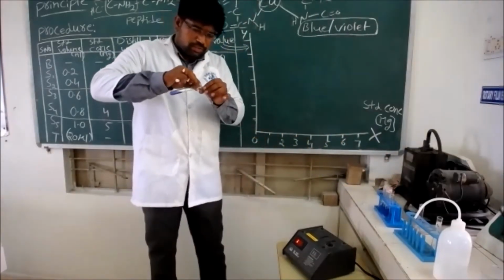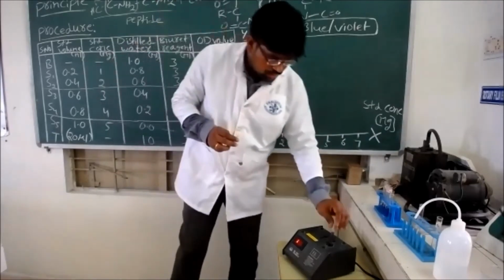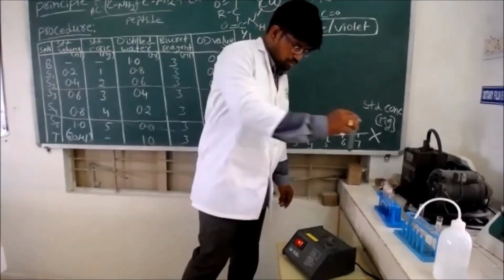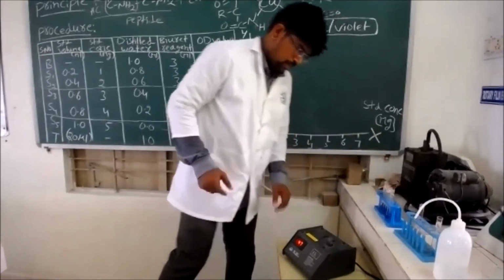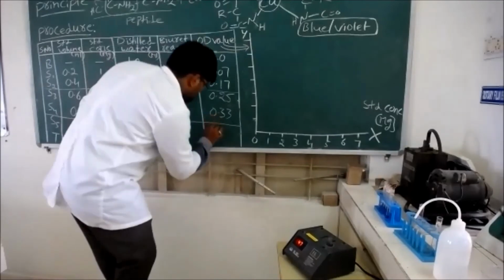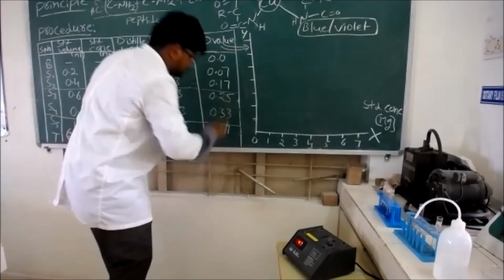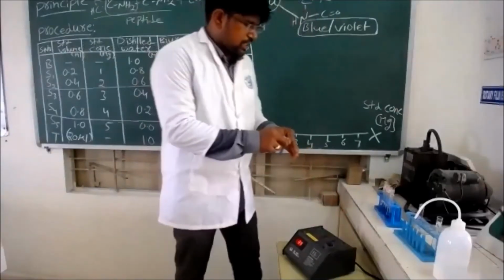Then you measure the S5 absorbance. So the S5 absorbance is 0.47. Now with this, the standard measurements were completed.